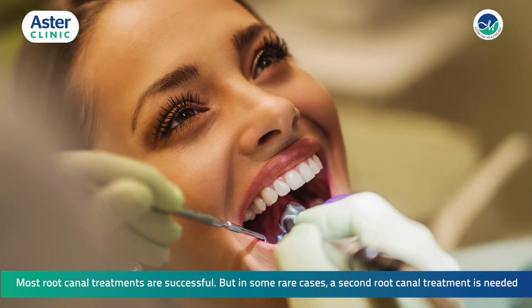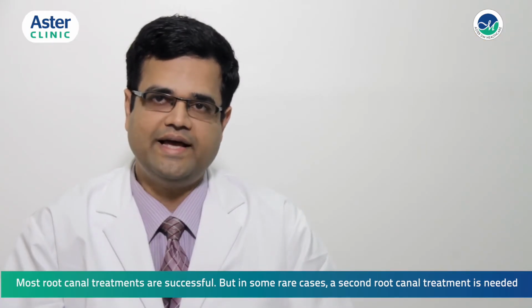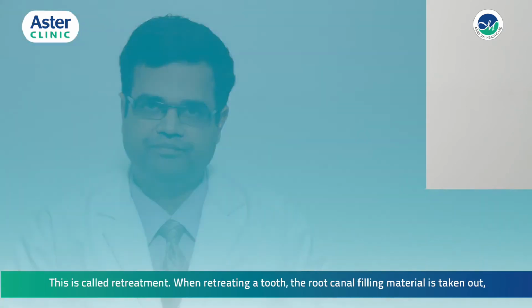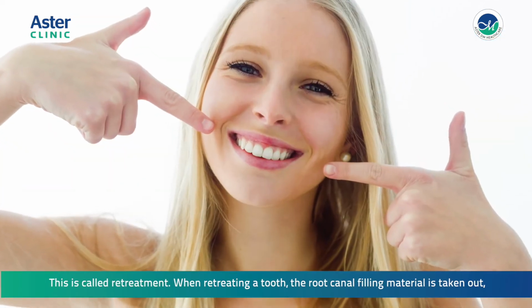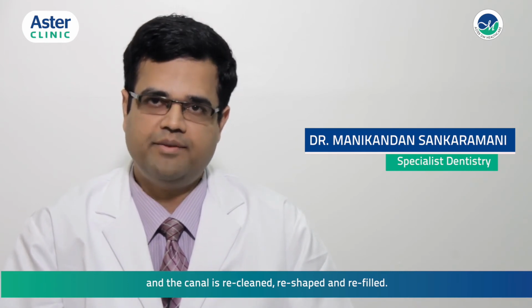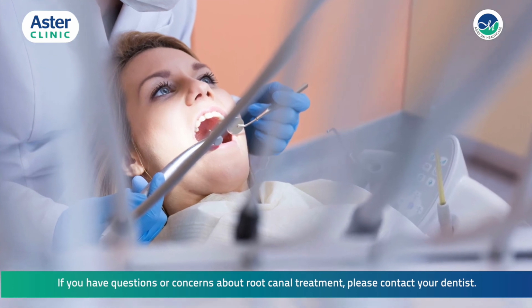Most root canal treatments are successful, but in some rare cases, a second root canal treatment is needed. This is called retreatment. When retreating a tooth, the root canal filling material is taken out and the canal is recleaned, reshaped and refilled.